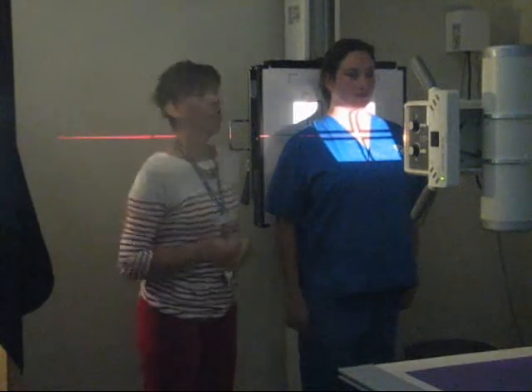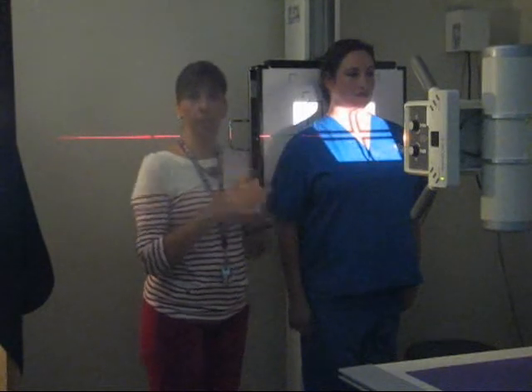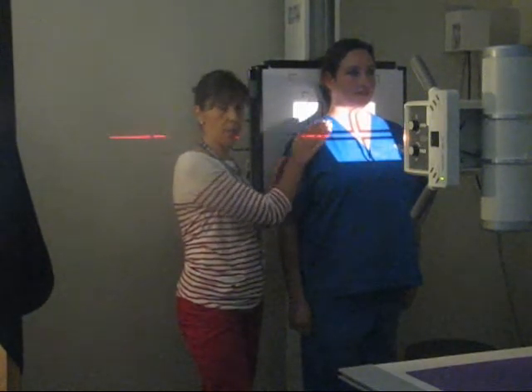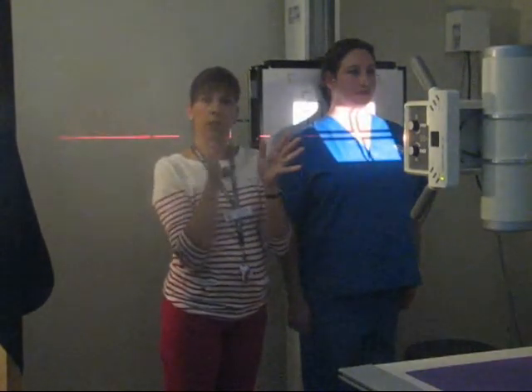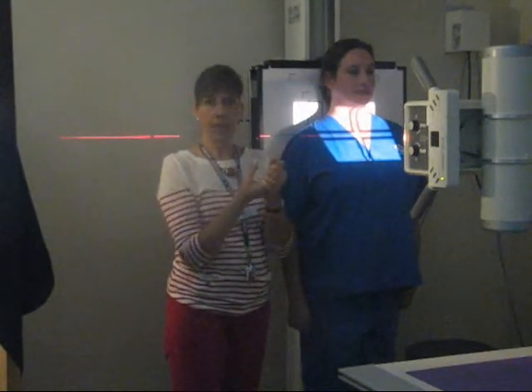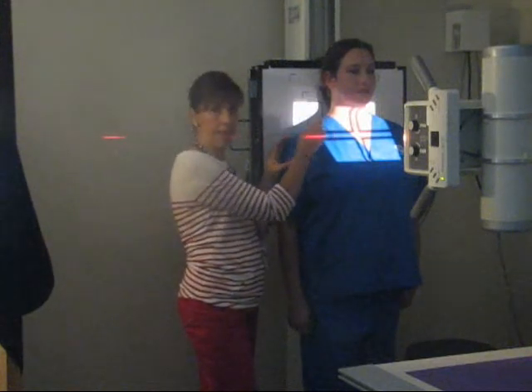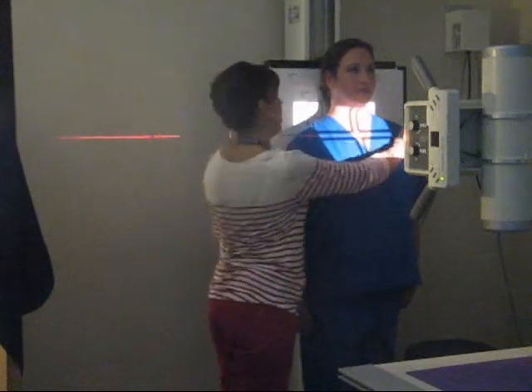Sometimes the doctor is going to want to make real sure that the integrity of the joint is preserved. So they're going to want to see that the space, not only the space in between the head of the humerus and the girdle is intact, but also that there are no deviations, there's nothing inside that joint that could be impeding that joint in some way. So what they want to see is they want to see almost the complete space from one end to the other. So we use a projection called an AP oblique.